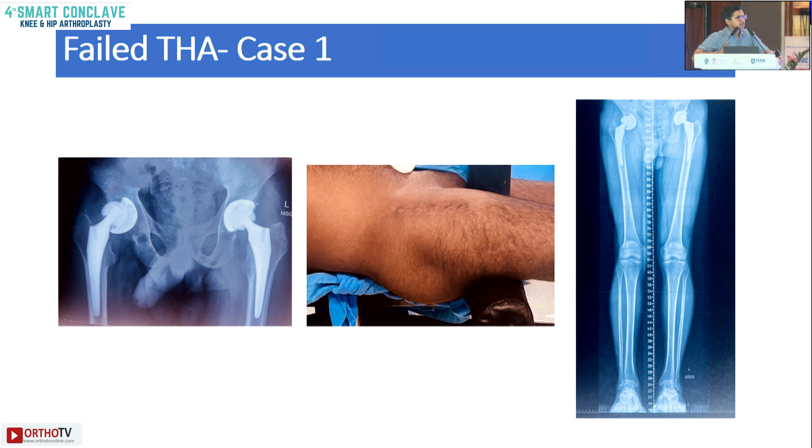This first case was done by the direct approach, referred to us. If you see the incision, the patient presented three months after surgery with a failed cup on one side and doing fairly well on the opposite side. One of the technical challenges with the direct approach workflow is that you cut the neck and remove the neck and head in one piece, then approach the acetabulum. Here you can't remove the neck because an adequately sized, well-osseointegrated stem is present, so you want to retain it. The technical tips to discuss are how to deal with the stem and proceed with revision surgery for the acetabulum.